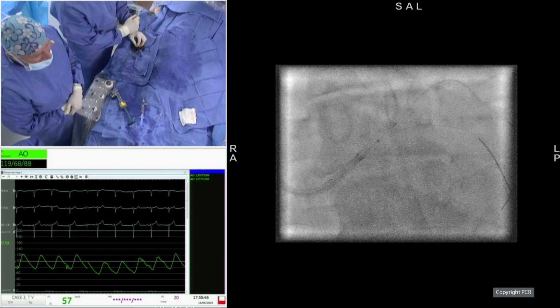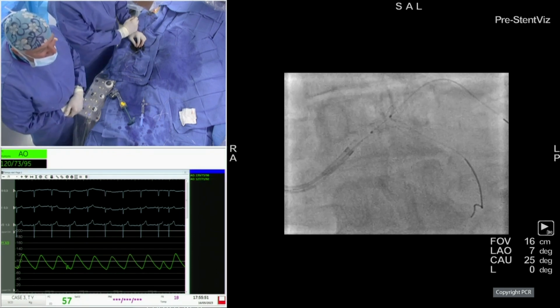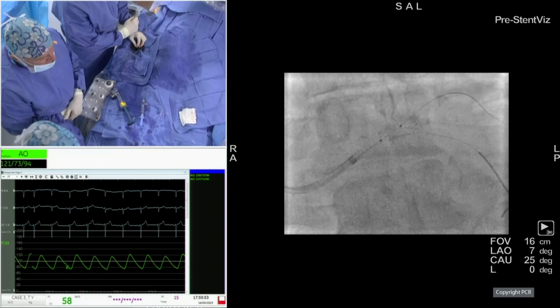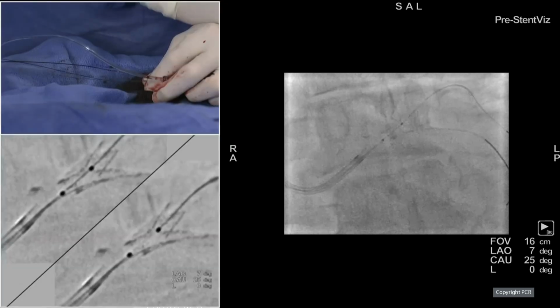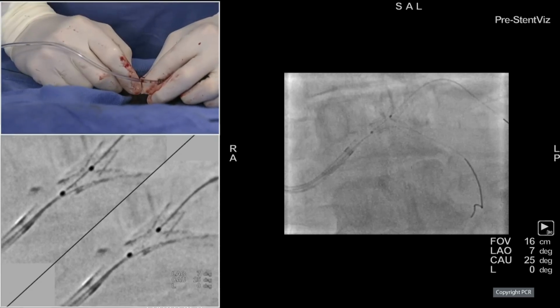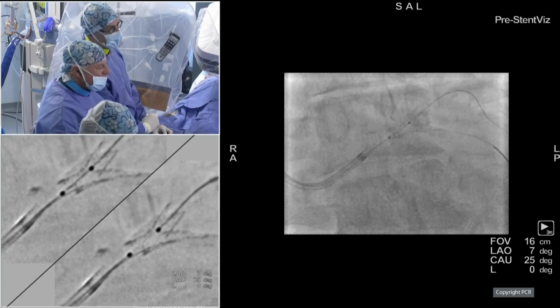On voit déjà. Okay. You can also do it with OCT. Yeah, the stent has shortened. You don't trust your eye. I think the stent has been shortened. Yeah. Clearly. Because you see the contrast. Now the contrast. Yeah. Bruno, before.